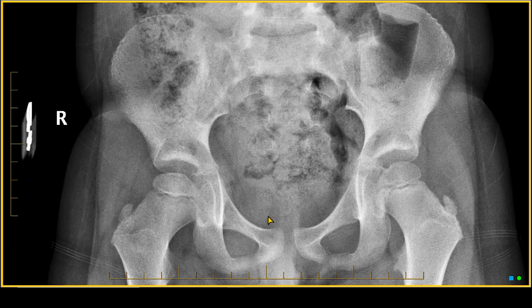First I look at the congruity of one hip joint versus the other. I look at the density, I look at soft tissues, and I look to see if there's a joint effusion.